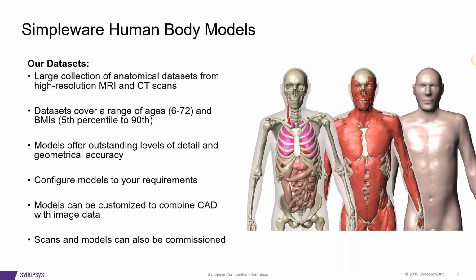Finally, if we don't have what you need in our data library, we do also have a number of collaborators and sources for new scans for even more application or region-specific models, where we can really look at the problems you're facing and how to solve those on a very bespoke level.